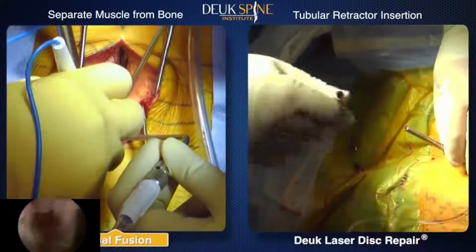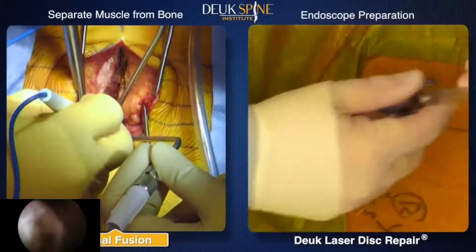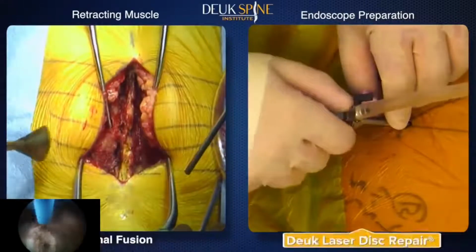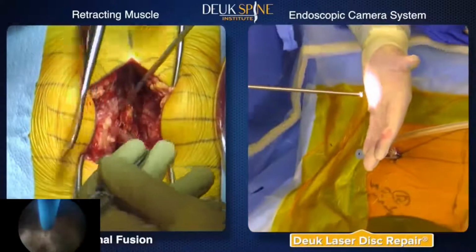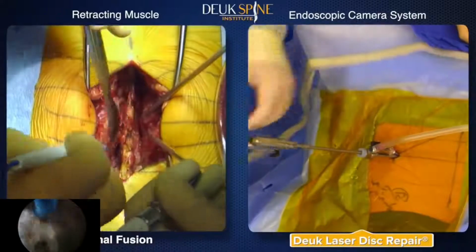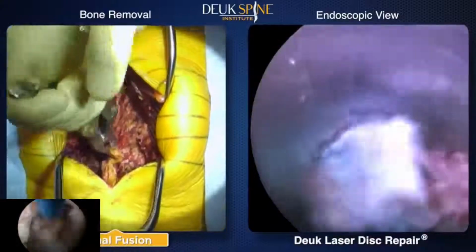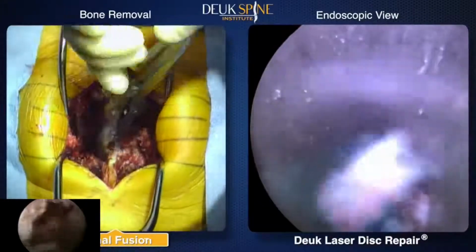To access the spinal fusion requires the muscle to be separated from the vertebrae. This very invasive action causes trauma and permanent damage to the muscles. Whereas in the endoscopic Deuk laser disc repair, the muscle is not damaged. The endoscope camera is inserted into the tubular retractor to allow the surgeon to guide the laser inside each symptomatic disc. To accommodate the fusion hardware, a large bone grabber is used to perform a laminectomy by removing bone from the spine.